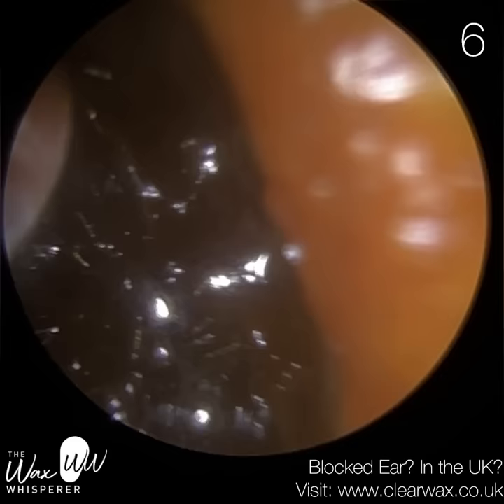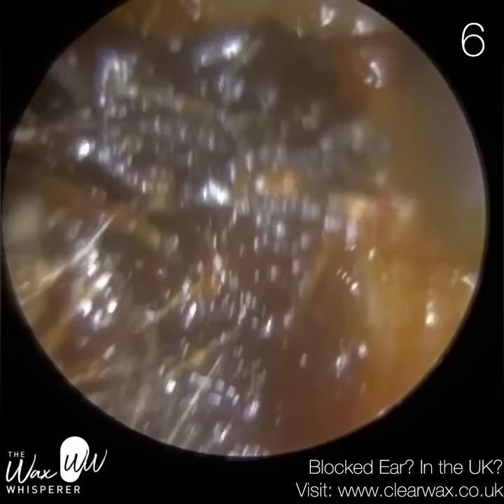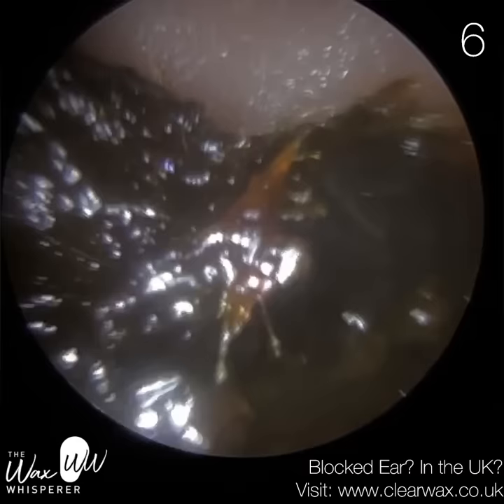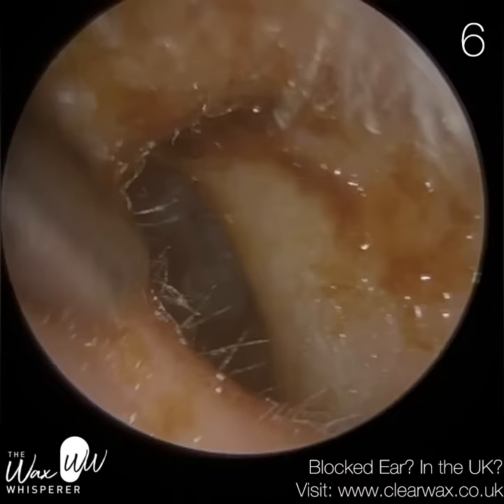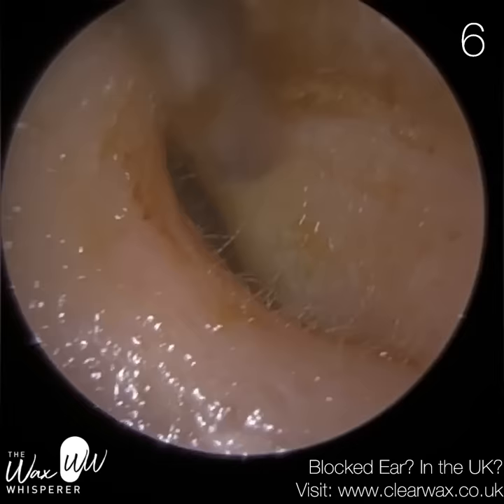Patient six — I've been using a lot of olive oil spray. As you can see, this wax is really wet, soft, and gooey. They have quite a bendy ear canal. You can see all that oil. The patient was instilling the oil and letting it sit, then tilting their head in the opposite direction so the oil could drain out — which is the correct way of doing it. That plug came out without much of a fight. We can see the first bend — going from left to right the ear canal straightens, and that's a beautiful-looking eardrum.